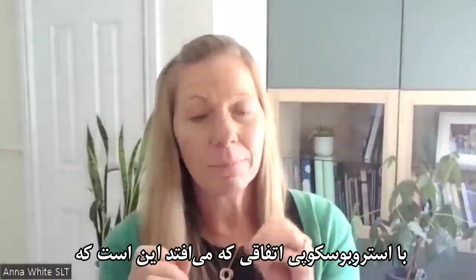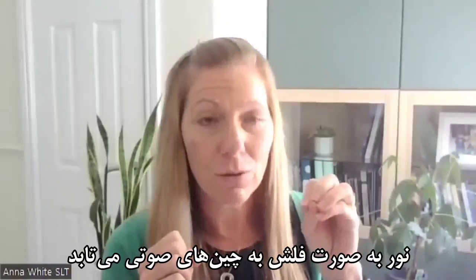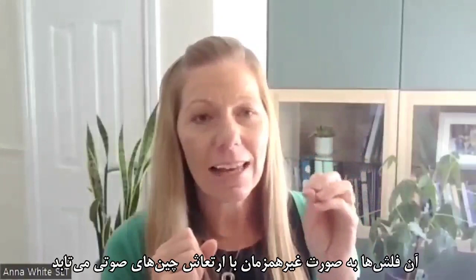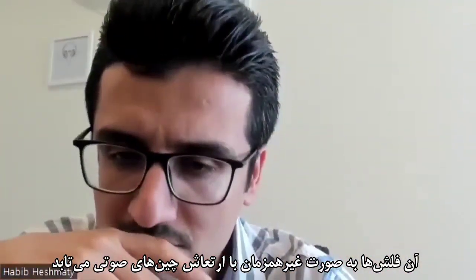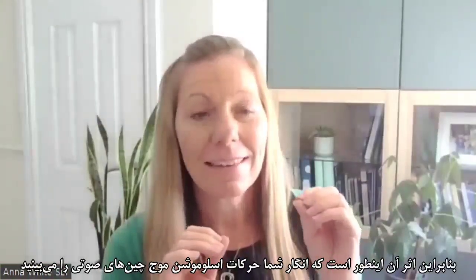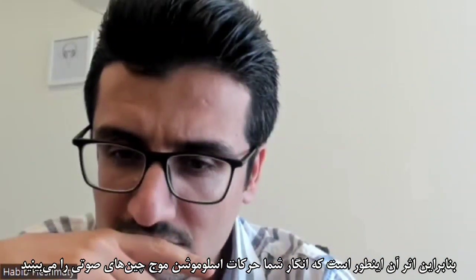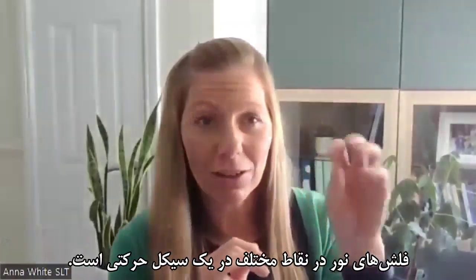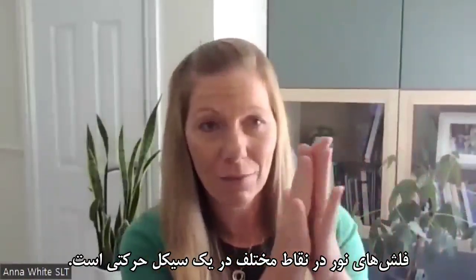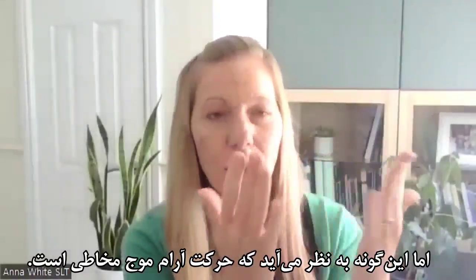With stroboscopy, what happens is it shines a flashing light down onto the vocal folds, slightly out of sync with the vocal fold vibration. The impact is that it looks like you're seeing a slow motion version of the vocal fold wave. You're not. What you're actually seeing is flashes of light at different points in the vocal fold cycle, but it gives the impression of a slowed down mucosal wave.